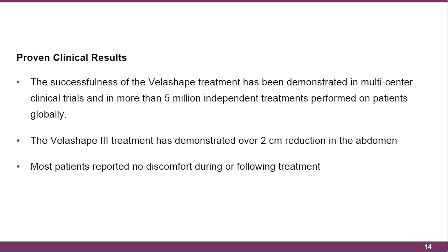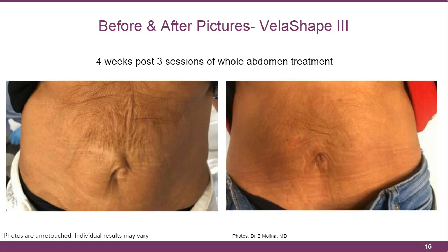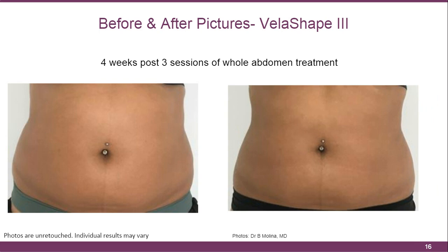This is another sample of just improving skin quality. This is just for the tightening, not so much the fat, as there is very little fat in here. And just remember that the machine also has a smaller head, which we will see in a minute, but also some flat heads you can use to just apply the heat and improve the skin quality, without having to suction if you have areas where it's difficult to do so. And this is, again, another one, one of my staff who tried the VelaShape, and again, really good results in 3 sessions, just for the abdomen.